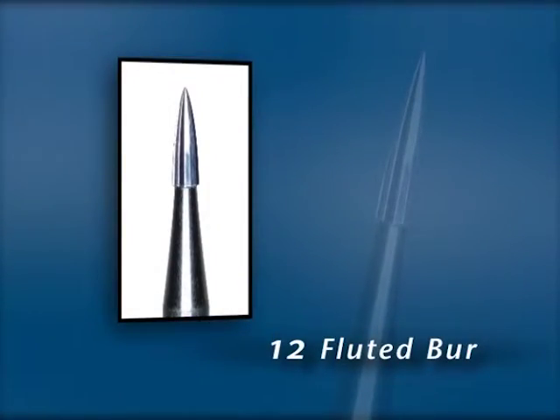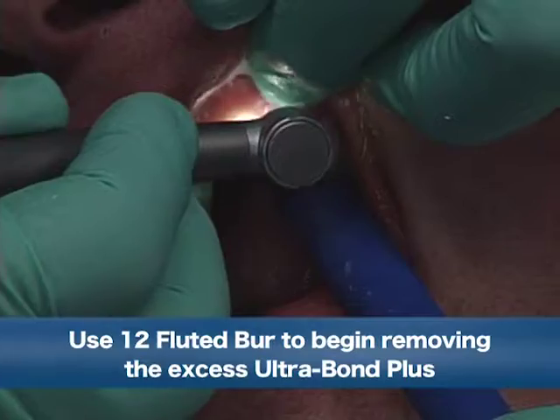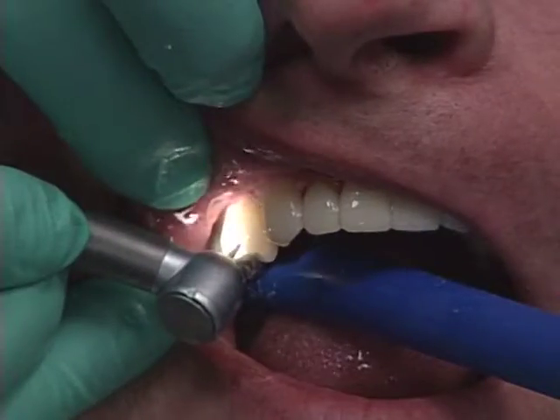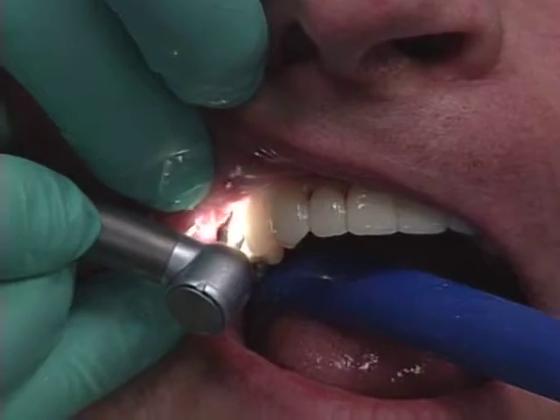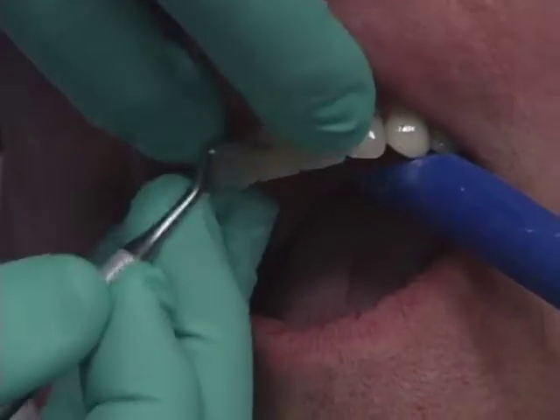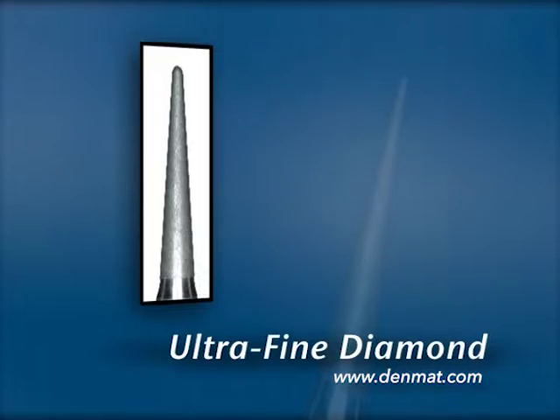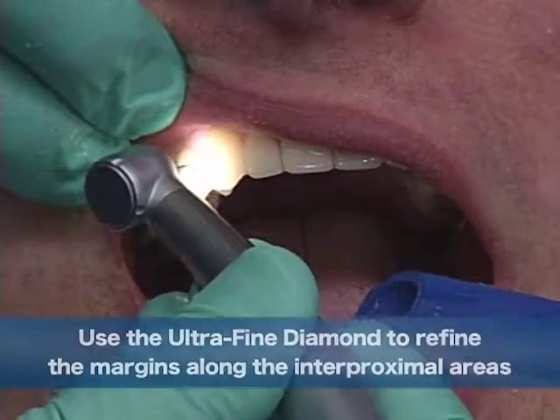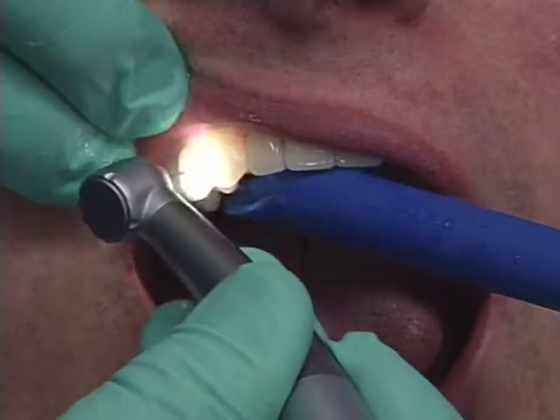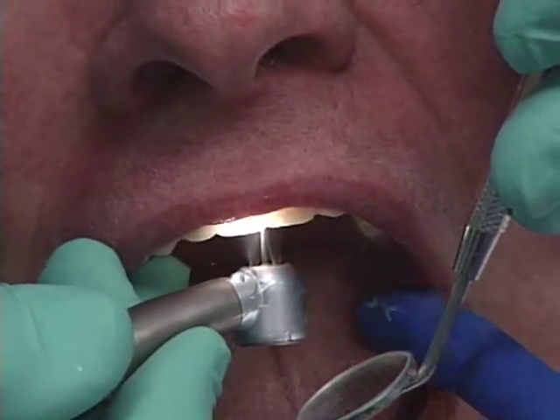Now I'm going to take a 12-fluted burr. Once in a while we don't get a contact open on the placement visit, and we open it on the subsequent visit, but the patient will be able to floss today. All of our margins are created with the porcelain, the Ultrabond, the Tenure, and the tooth — and they are one solid fused mass, and that's how we get that great margin. The Sher 349 will never scratch the glazed surface. I'm going to get back into the cuspid and bicuspid areas with a longer finishing diamond and go to the interproximal, and then go on the lingual side following the embrasure.